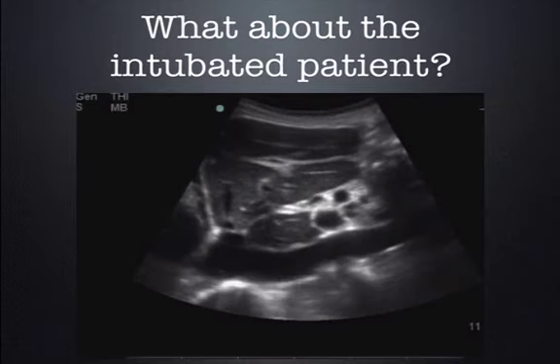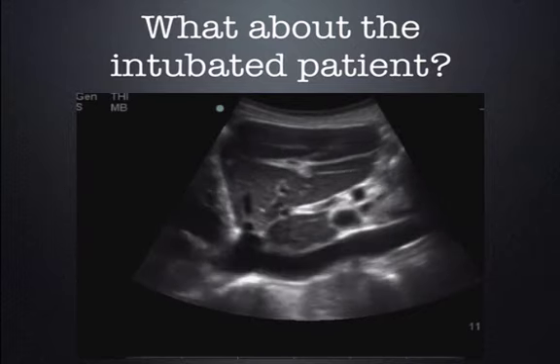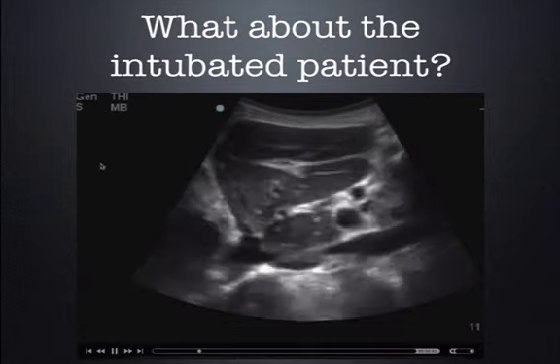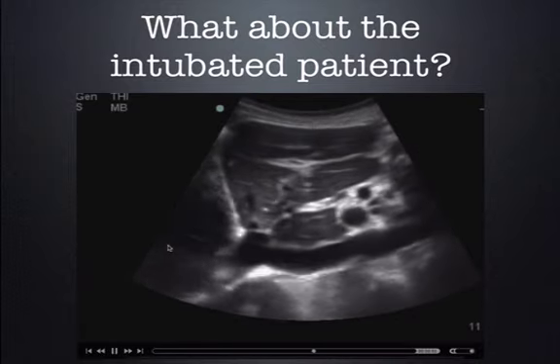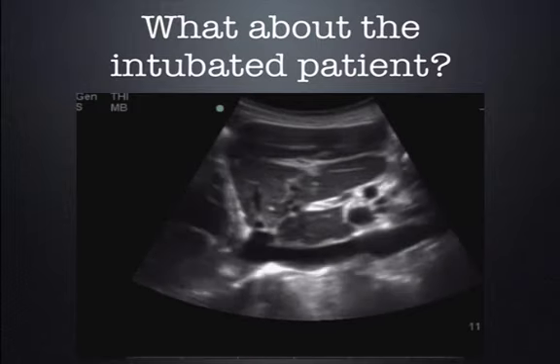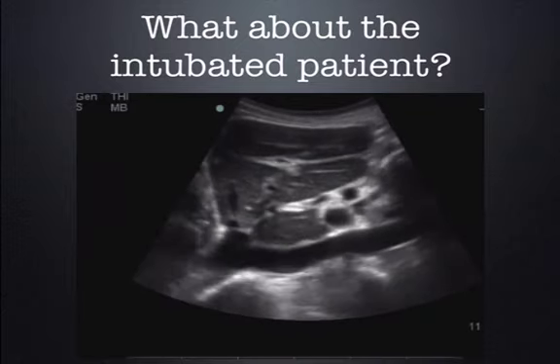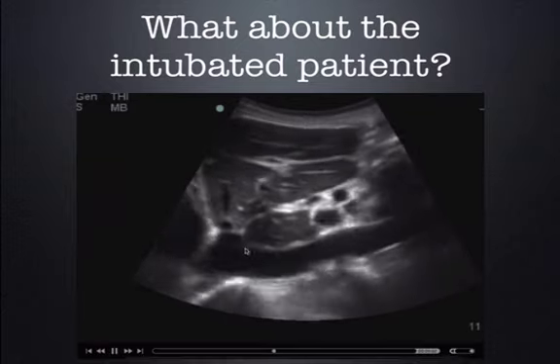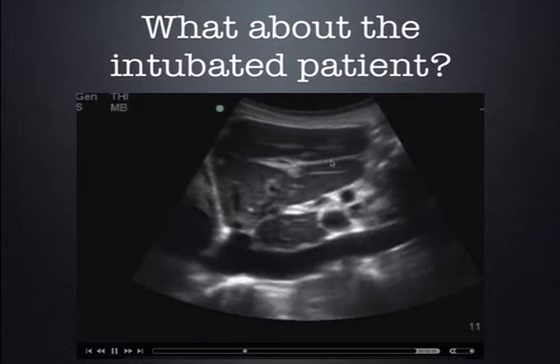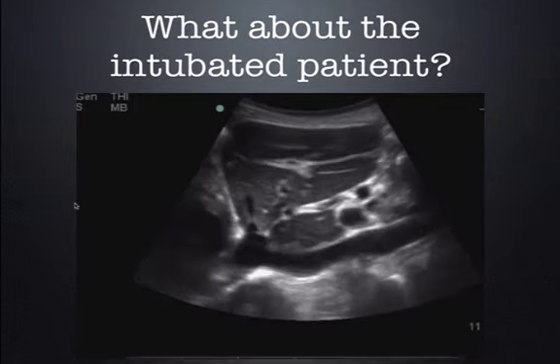So up until this point, we've talked about patients who are spontaneously ventilating. Patients who take their own breath, they generate a negative intrathoracic pressure which pulls air into the lungs. Not only does negative intrathoracic pressure pull air into the lungs, it also sucks blood up into the thorax. Just like if you were drinking water or a Coke through a straw, you generate a negative pressure in the oropharynx which pulls that drink up into your mouth. In exhalation, the IVC is at its largest diameter. Here the patient takes a breath in, the diaphragm and the liver go down towards the feet, narrowing the IVC.